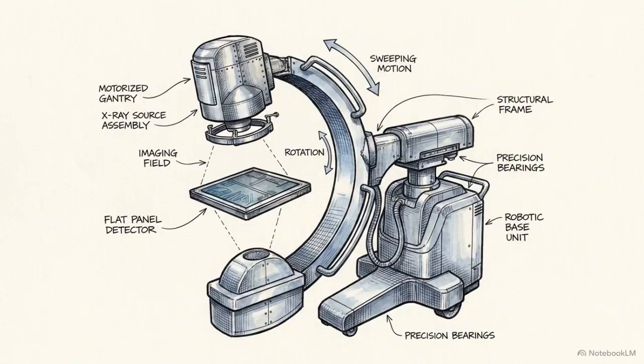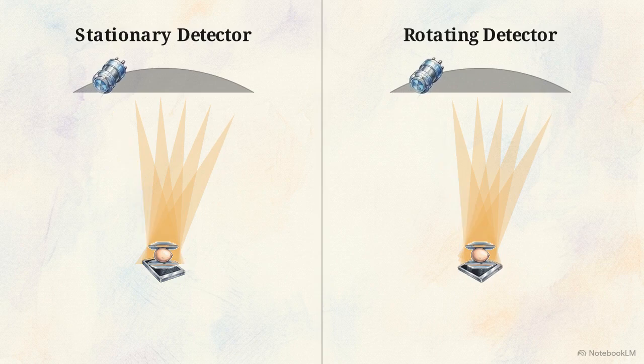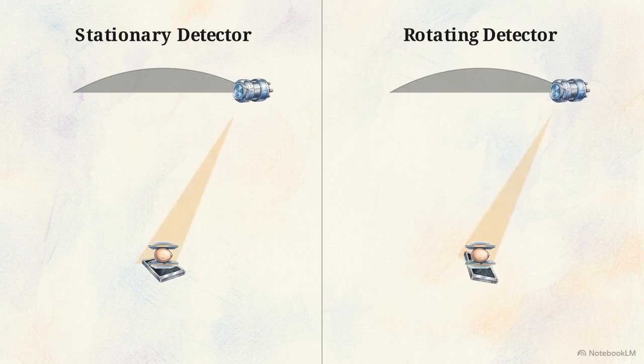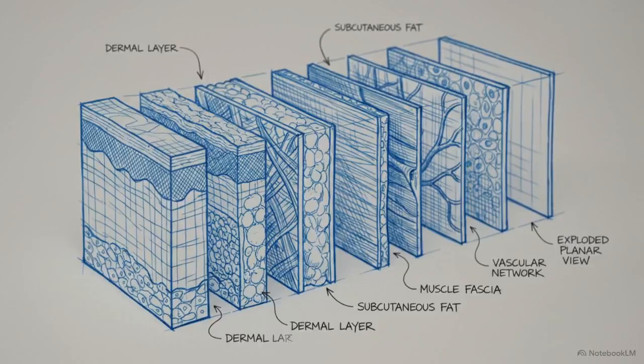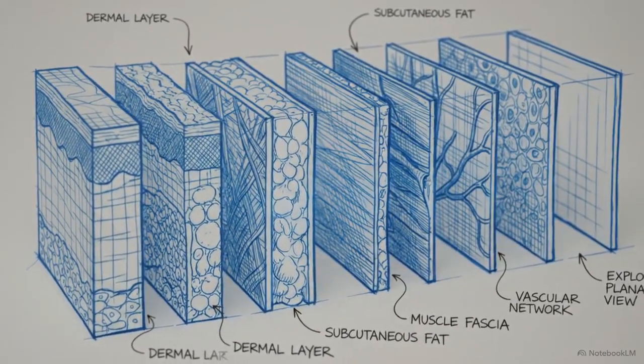Despite spectral tuning, geometric alignment, and heavy compression, a 2D projection still suffers from superimposed tissue that can hide pathology. Breast tomosynthesis is the architectural evolution of the C-arm, designed to overcome this limitation. In this schematic, the X-ray tube traverses an arc above the breast, acquiring discrete images from varying angles by firing individual pulses. Two variations exist. On the left, the bottom detector remains stationary. On the right, it actively rotates in sync with the arcing tube. The system runs all this data through reconstruction algorithms to output clean planar images of different depth sections.